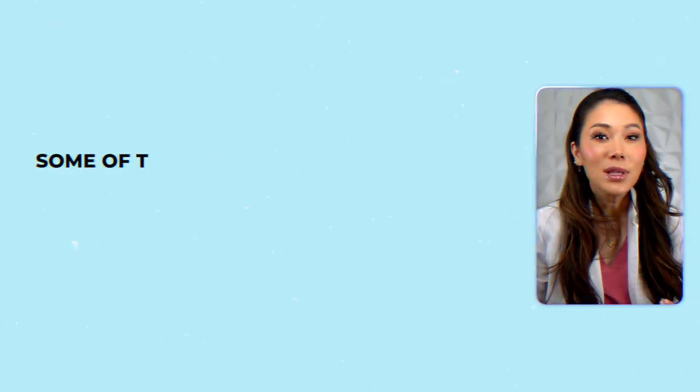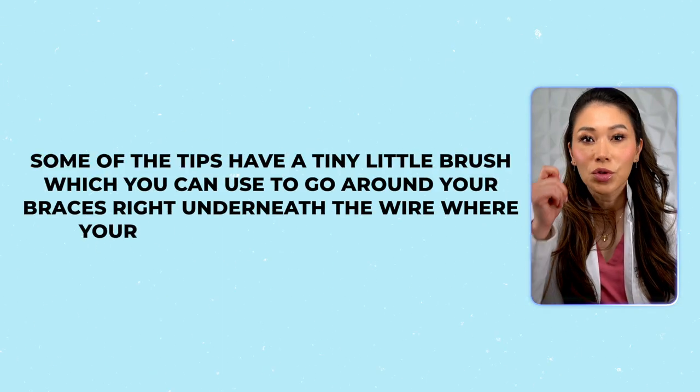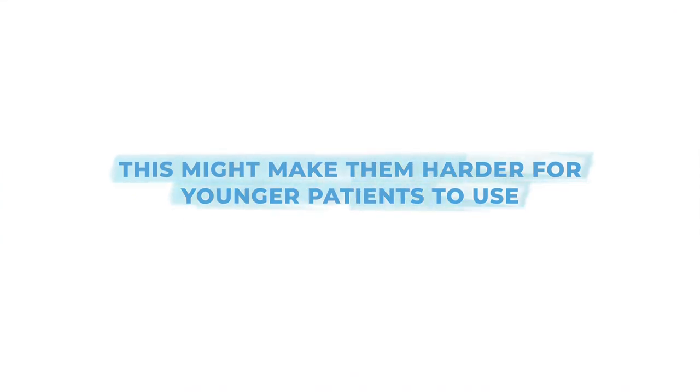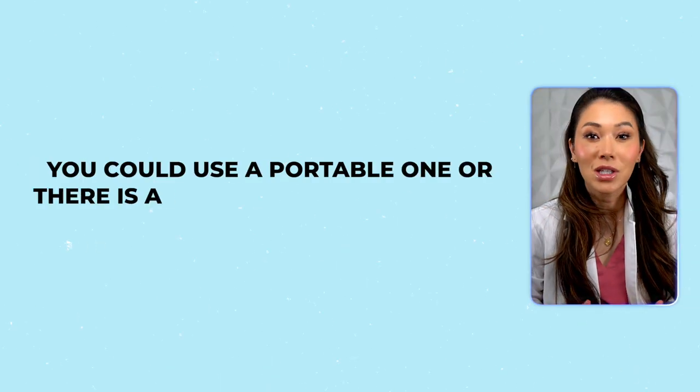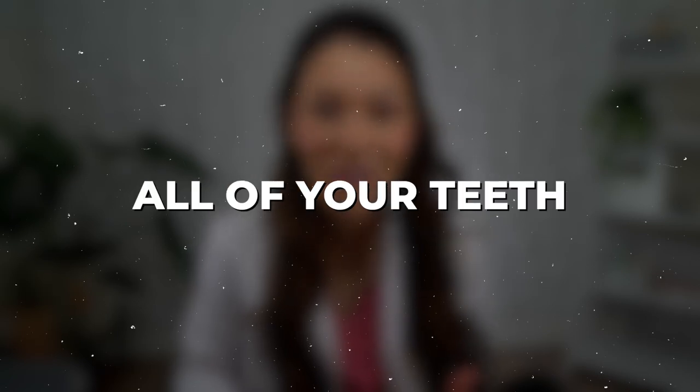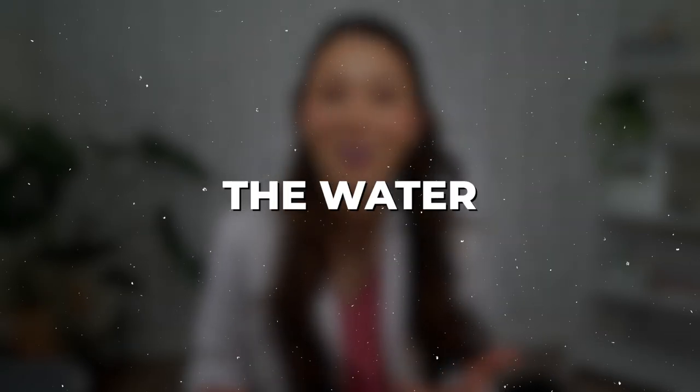Now, depending on which type of water pick you get, you might even have one with interchangeable tips. For example, some of the tips have a tiny little brush which you can use to go around your braces right underneath the wire where your toothbrush doesn't reach. Water flossers can get a little messy and take some practice to get used to, which might make them harder for younger patients to use. Since there are a lot of different models out there, you have options — for example, you could use a portable one, or there's also one that connects to the faucet in your shower, so you can easily clean all of your teeth without worrying about water getting everywhere.